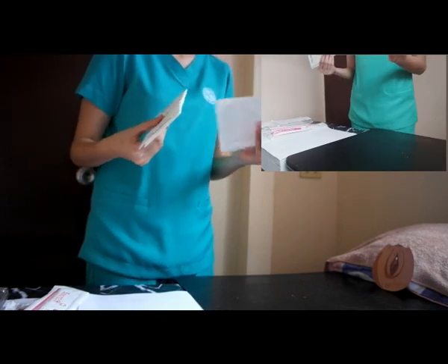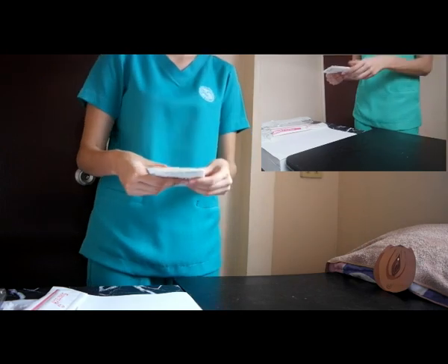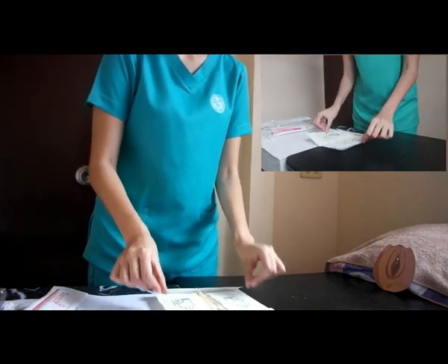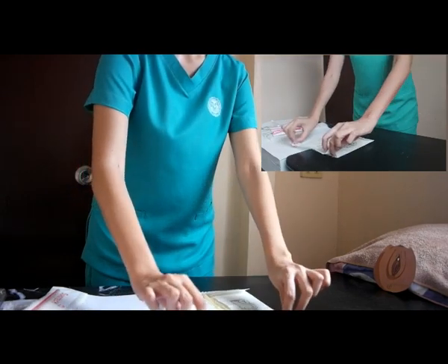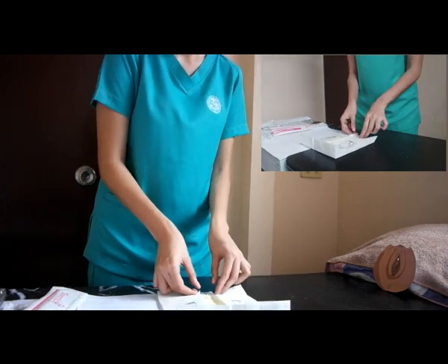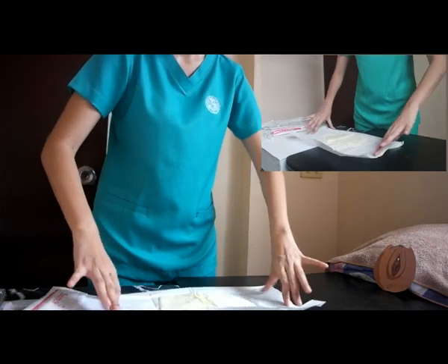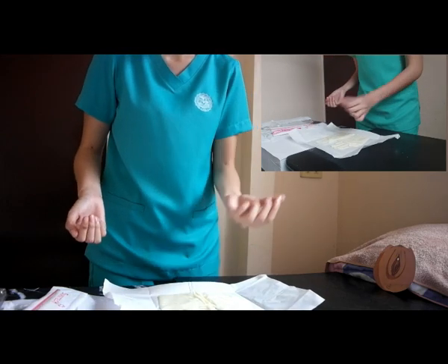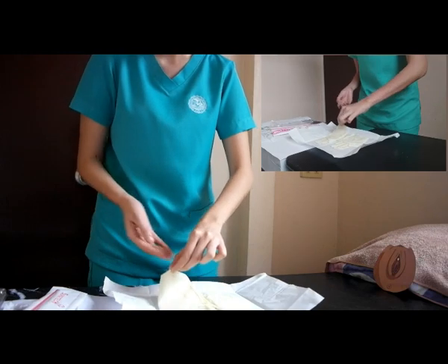And then you can dispose there in one area in an unsterile field. You can use your left hand so that you can insert your gloves.